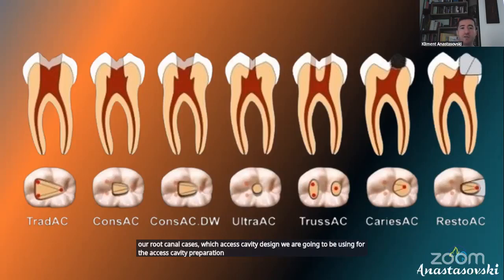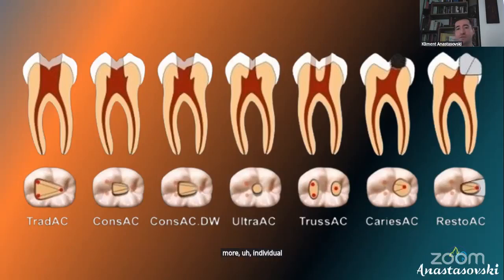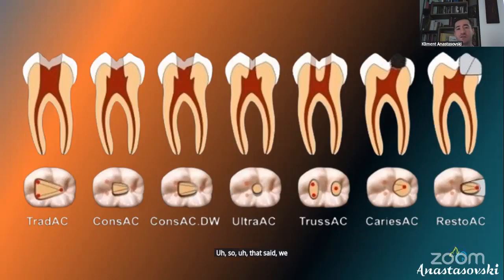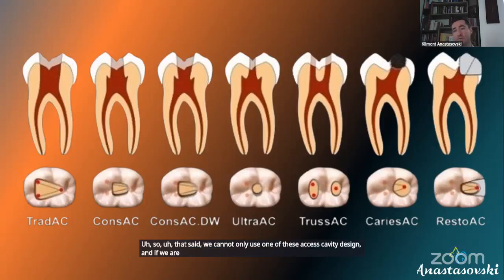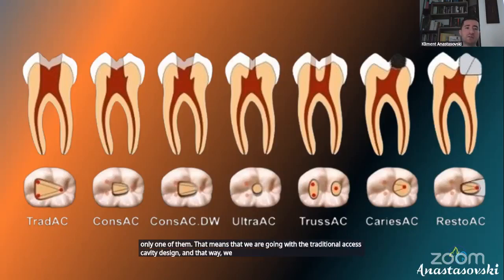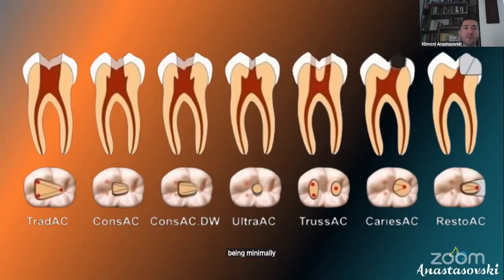But in my opinion, we need to have a more individual approach to each and every one of our root canal cases if we want to be minimally invasive. That said, we cannot only use one of these access cavity designs, and if we are using only one of them, that means that we are going with the traditional access cavity design, and that way we are not being minimally invasive.